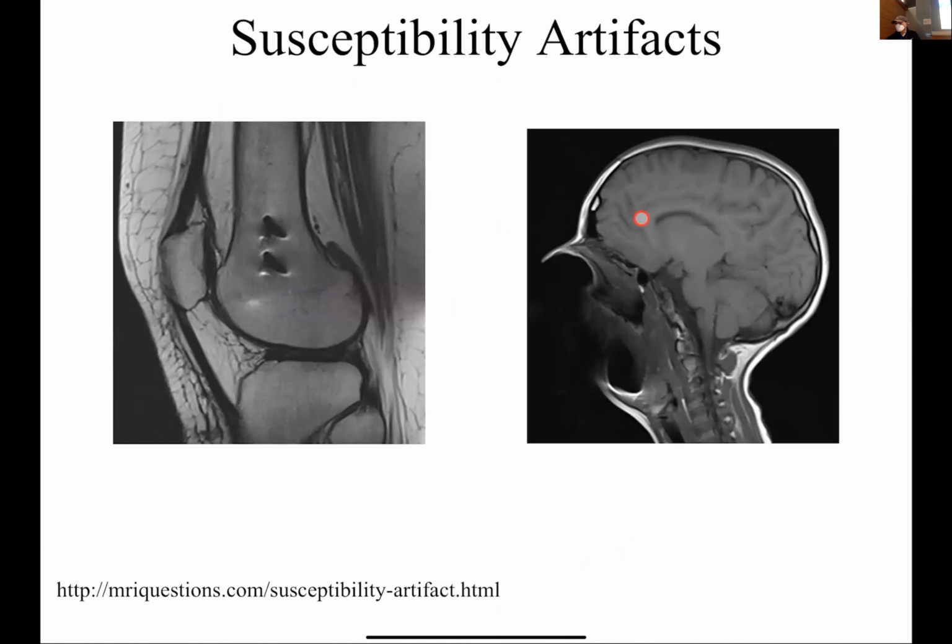Okay. So this person here, I mean, this looks pretty bad, right? Is this person missing a mouth? What's going on? What do you think is going on with this picture? Let's say I told you this person is perfectly healthy. So what do you think this person has? They must have something in their mouth that's causing this decay. So any guesses?